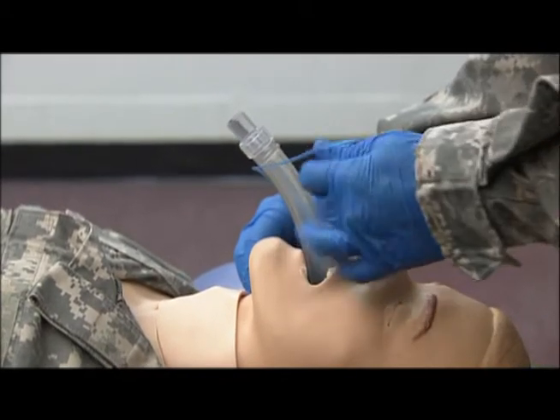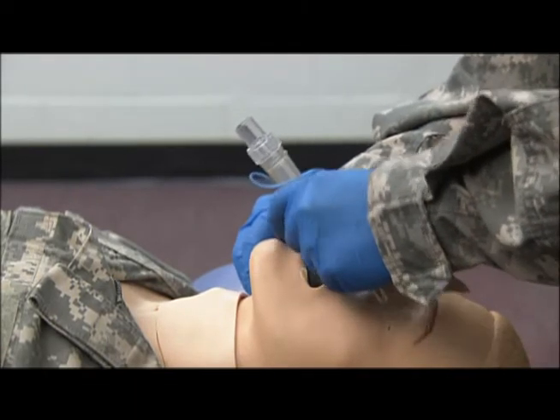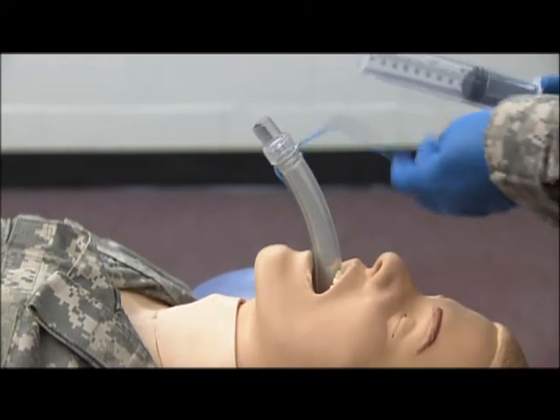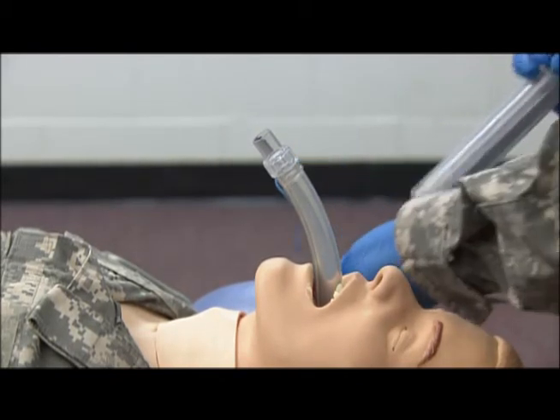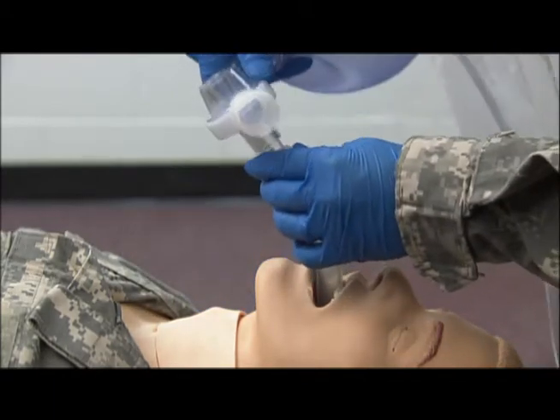This is not going all the way to the trachea — it's a supraglottic apparatus, so it sits above the trachea and esophagus. At this time, we want to inflate the device and connect our bag valve mask.